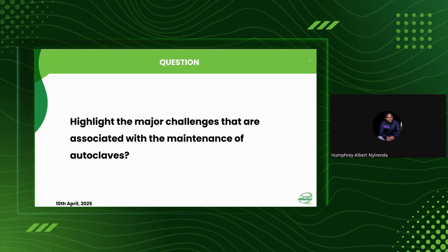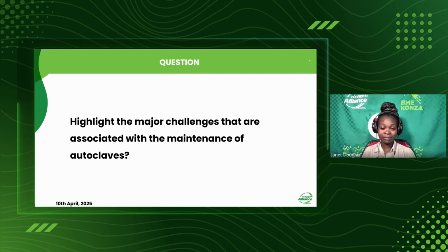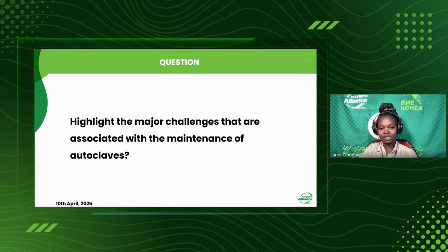So that is an indication of an issue or fault with the electrical system. Either the earthing is not satisfactory or there is touching elsewhere of the live wire or the neutral wire with the chassis of the equipment at hand. Thank you very much. That's what I can say. Thank you very much for that well elaborated explanation to this scenario.